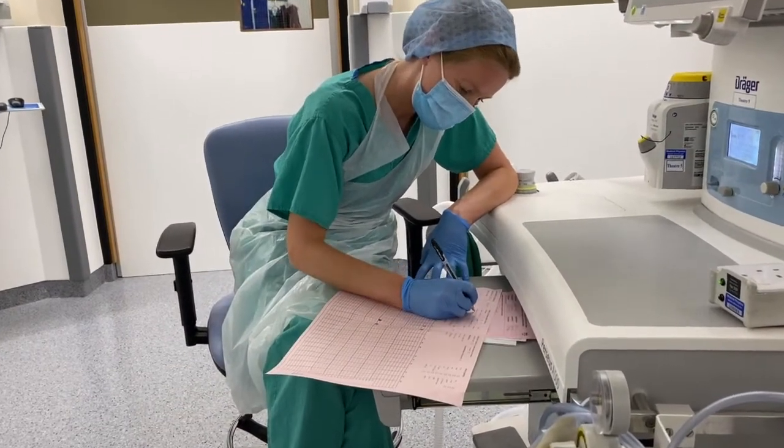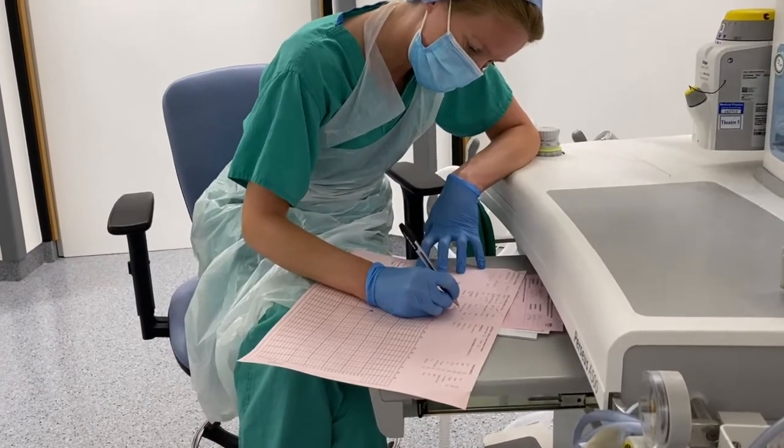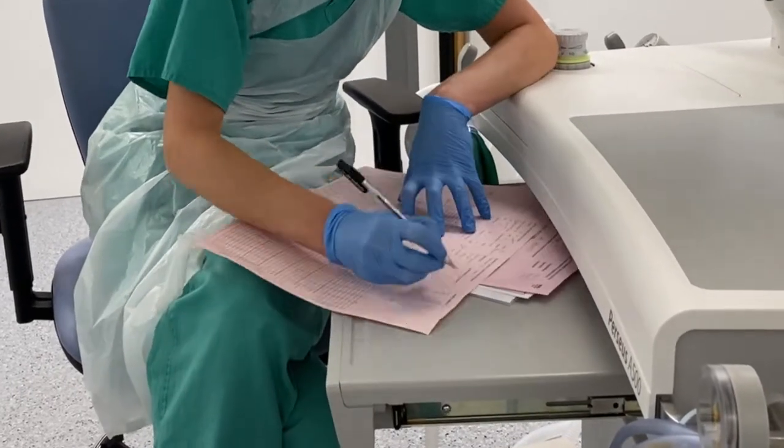Post-procedure. Documentation of basic airway management is vital, including information regarding both anticipated and unanticipated difficulties, one or two hand technique, and the need for airway adjuncts.